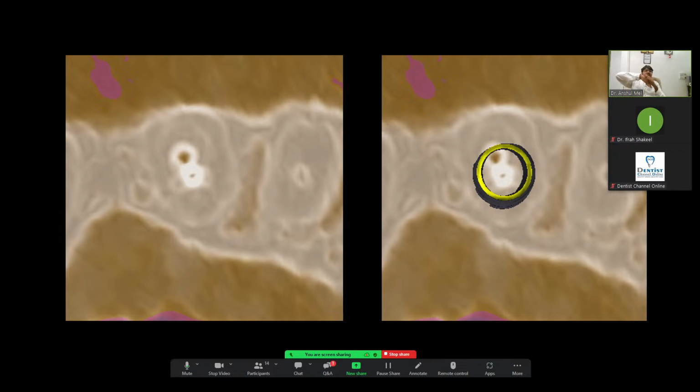So on the buccal side, resorption of bone will not occur and it will stay for a longer time. But the problem is that if I do the same thing freehand, I will cut the tooth in two sections, take out the buccal section and start implant placement. So I will go more palatally, and there is a bulge in the prosthetic while giving the final prosthetic.